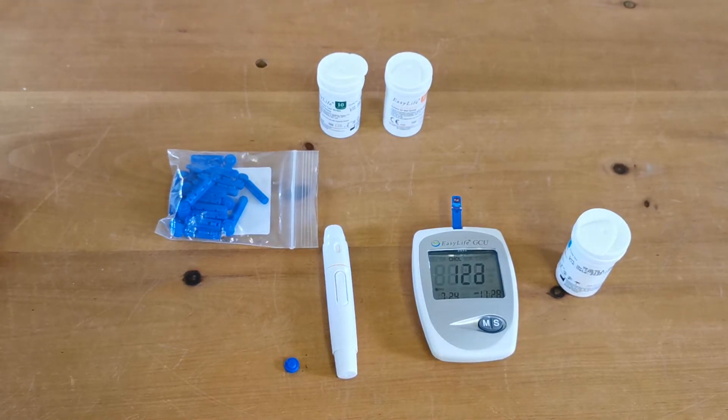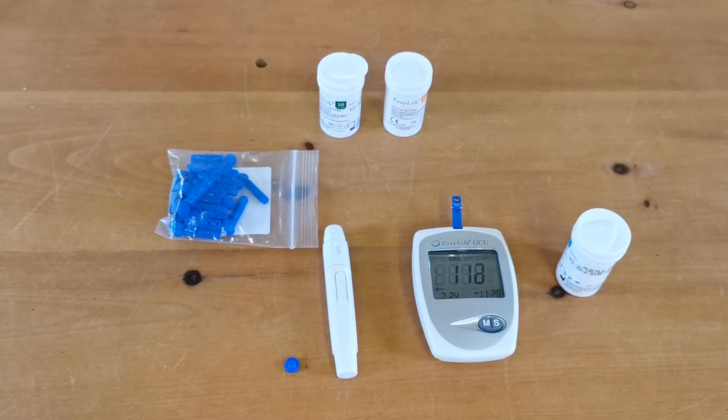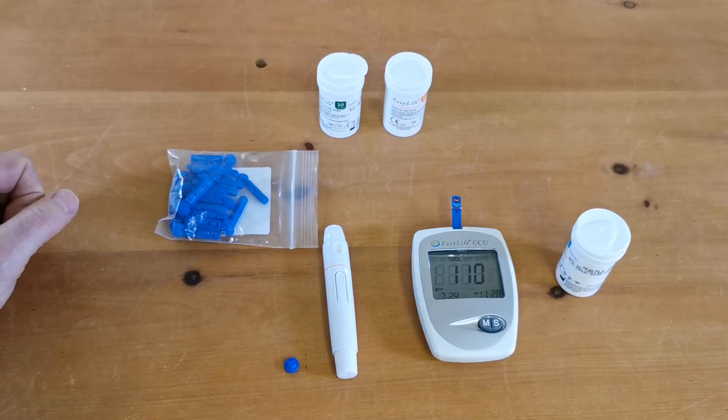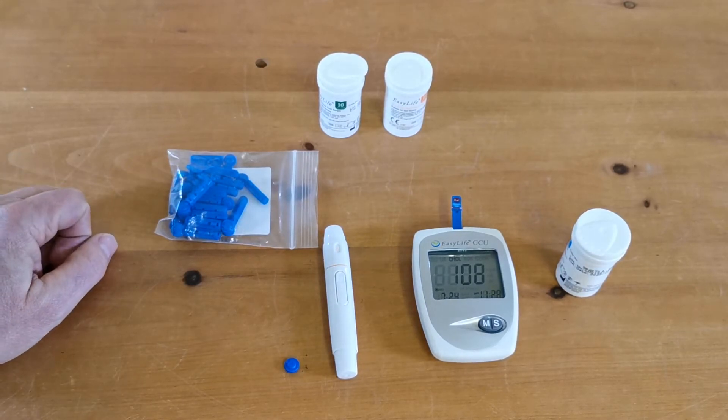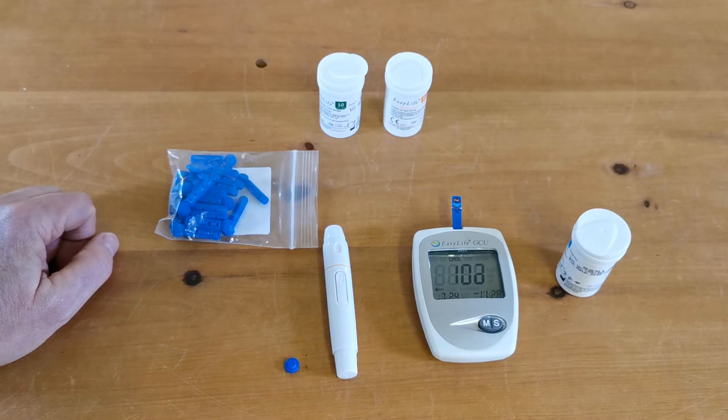We're going to let that meter count down. Once it's done the calculation it should display — we've set this meter up to show in millimoles per litre, so it should show my actual cholesterol level in millimoles per litre. That's working down now, just coming to the 100 countdown mark.